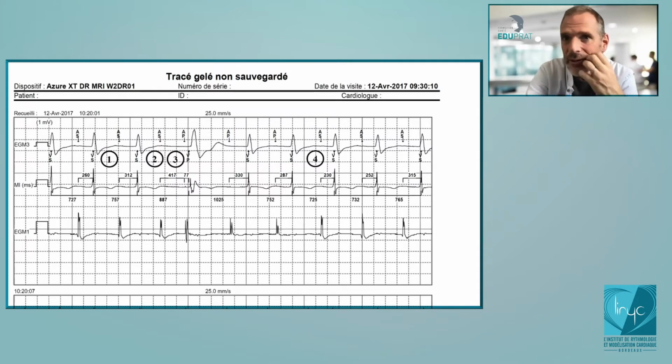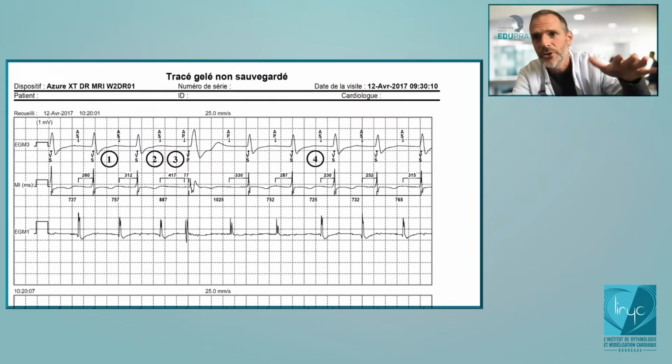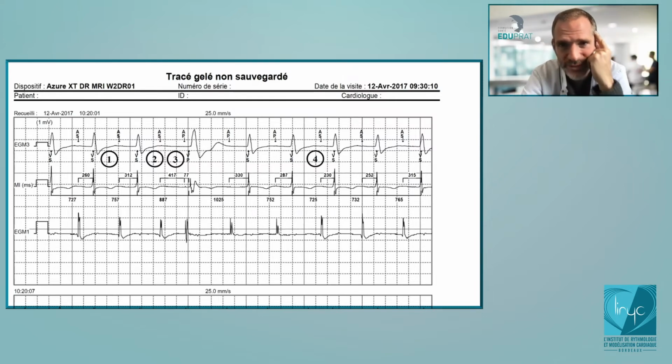I have a lot of discussion with physicians from the United States, for example, and they consider that if you implant a pacemaker, you cannot tolerate any pause, because sometimes the pause will be the cause of induction of an arrhythmia. So the idea in the new version was to decrease the duration of the pause.